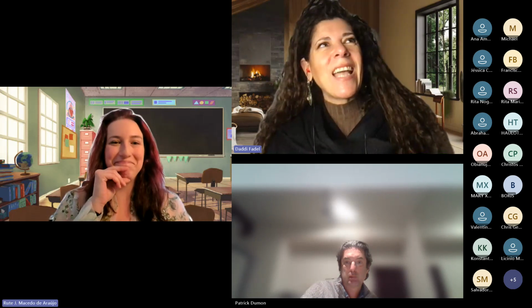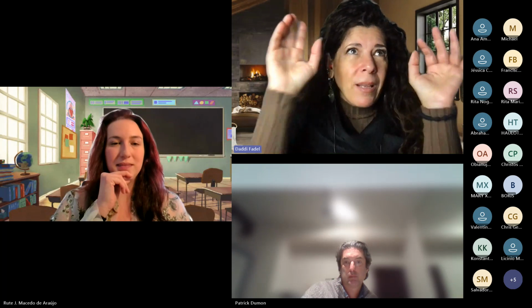And it reminds me of Ken Pullum, who loves scleral lenses, and he continues to say that we are complicating the fit with so many advanced designs and so much advanced technology. Fitting a scleral lens is so simple. You apply the lens on the eye, look at it, see what the problem is, and resolve it. That's it. And actually, the scleral lens on the eye is your topographer. It is our scleral topography.